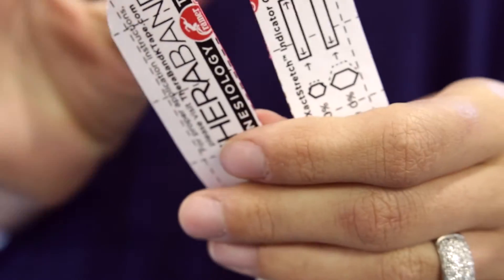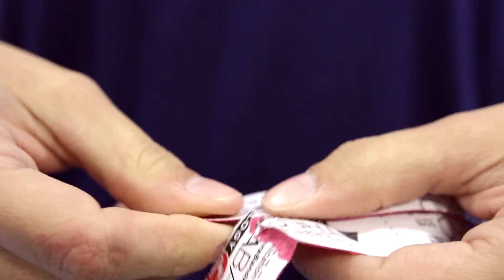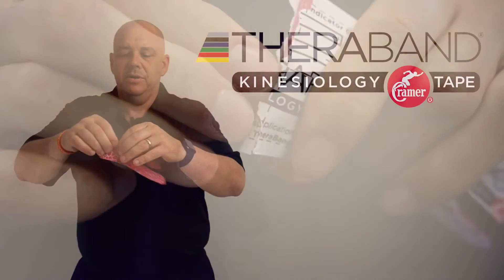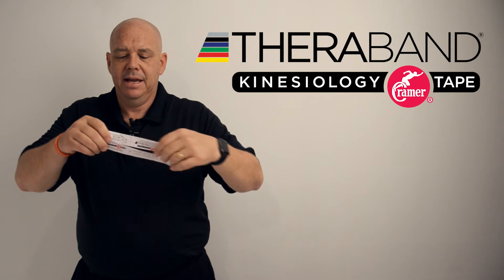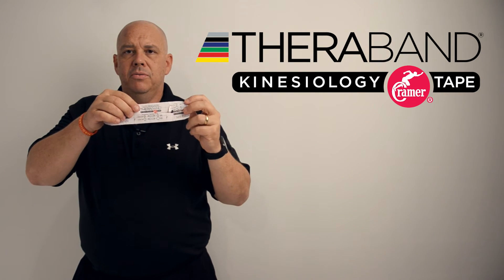When I go to apply this tape, I'll simply break the backing for the anchors of both tails, and I also like to break the backing of the bottom anchor. That way, when I go to apply the kinesiology tape, I'll have my anchors pre-torn and my effective length in the middle remaining.